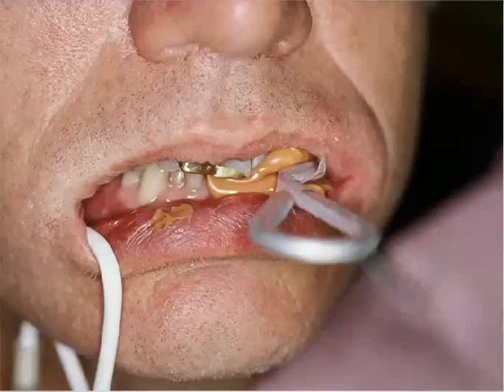We also have to be mindful of the fact that triple tray can be an issue. One study pointed out that more remakes were created when the clinicians used triple tray. If it is used, I think you can use it for a single crown at most. There are things you have to keep in mind. One is, if you are going to use triple tray, make sure you use a metal tray. Plastic trays have a tendency to deform more, create enlarged dies, and that can be a real problem when it comes to accurate fitting restorations.